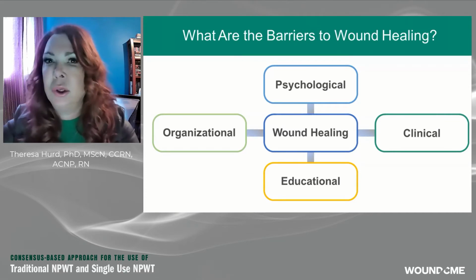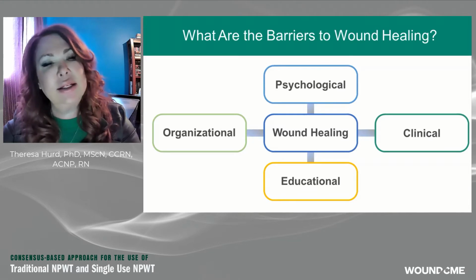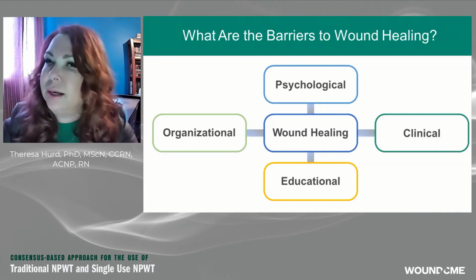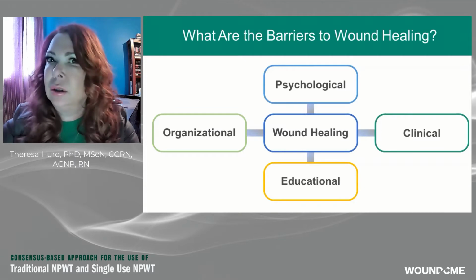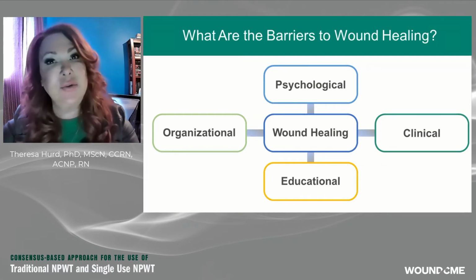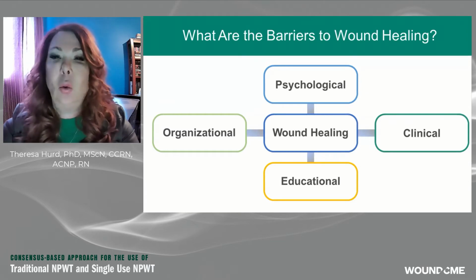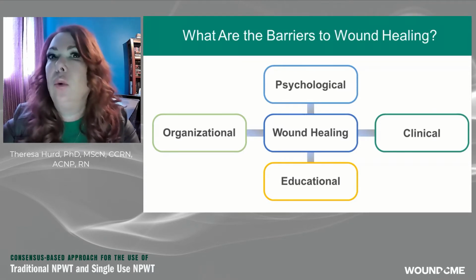We're so used to doing, that we might stop and think about, what does it mean if this patient has to walk around with the machine? In other words, clinically, I know this might be the quickest way to close this wound, but what's the impact for the patient? What are the safety issues for the patient? What if it's a younger patient, is there a developmental issue if I'm starting something such as negative pressure? What about clinicians? Is every clinician able to do the type of treatments and assessments that we need to heal patients in a timely manner?